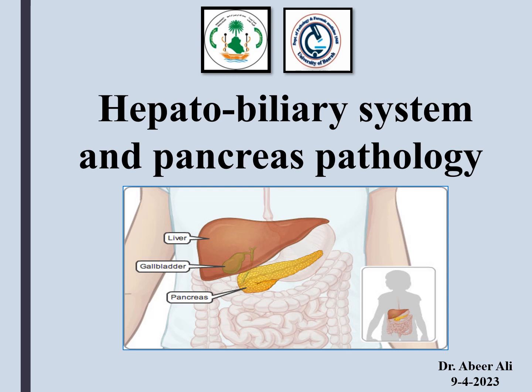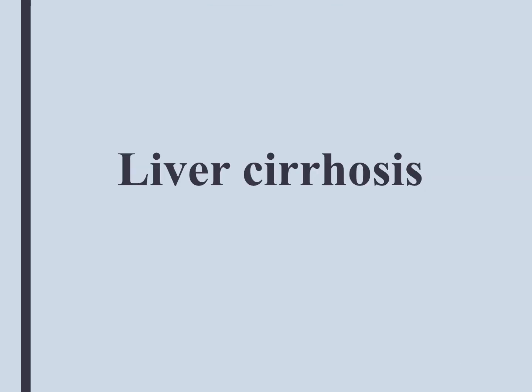Dear students, I'm Dr. Abeer Ali, and I would like to present to you a practical lesson regarding the pathology of the hepatobiliary system and pancreas. The first topic is liver cirrhosis.